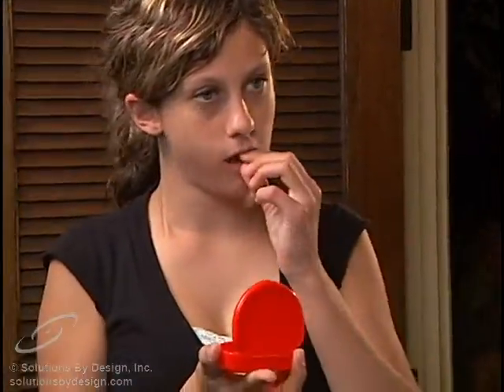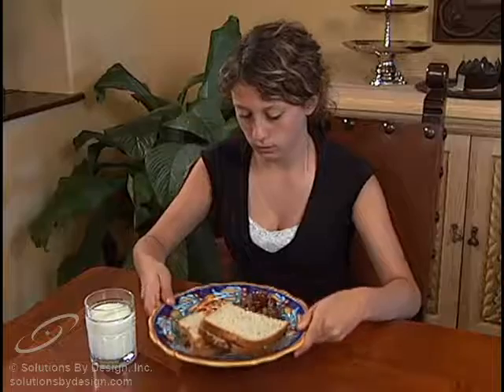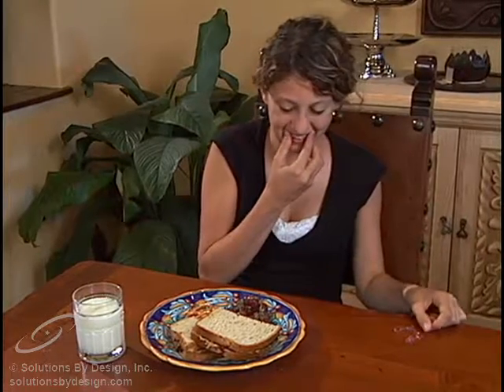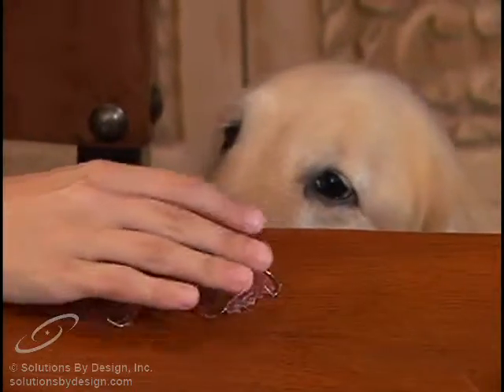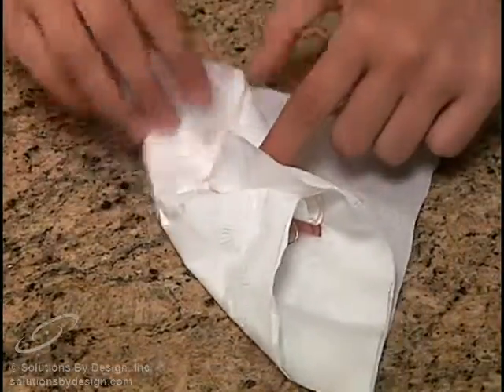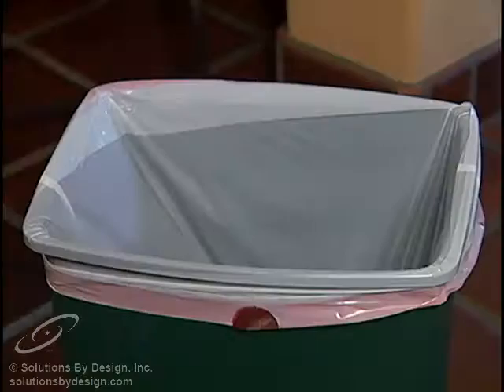When your retainers are not in your mouth, they should be kept in their case. Do not put them on top of a table where they can be dropped or left behind, or in a pocket where they may be easily cracked. Keep them away from dogs, as they have a tendency to chew them. If you must take your retainer out, be sure to never wrap them in a paper towel, napkin, or tissue, as this is the most common way of losing a retainer.